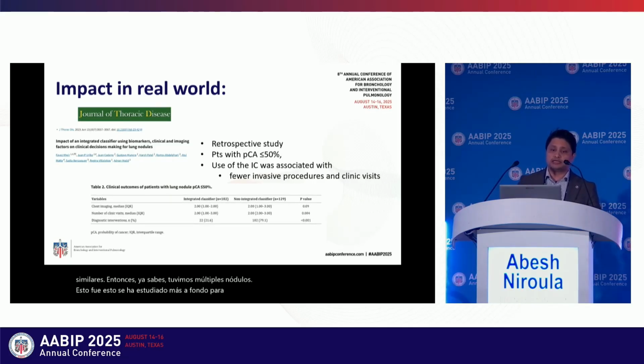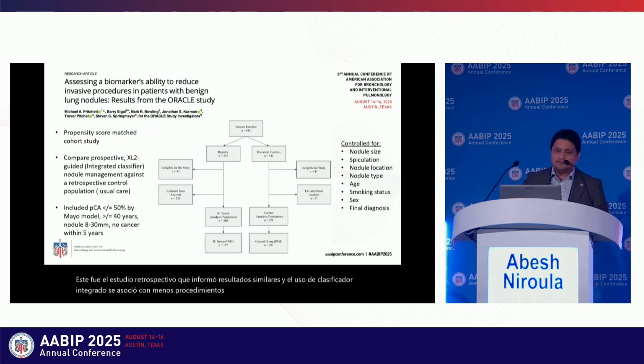This was a retrospective study which reported similar outcomes, and the use of the integrated classifier was associated with fewer invasive procedures and clinic visits. The ORACLE study group wanted to go one step further. They did a prospective study looking at whether the procedures would actually be fewer.